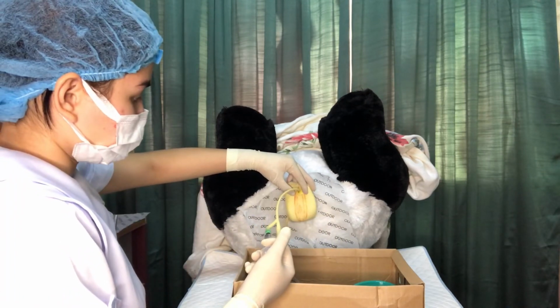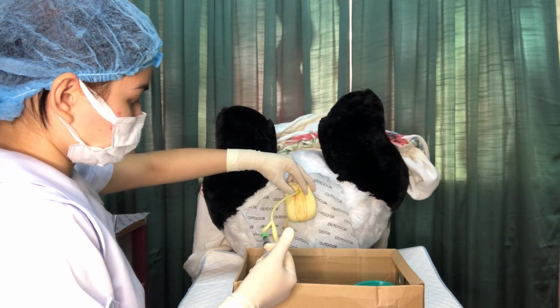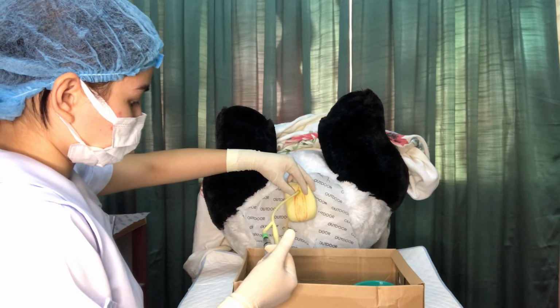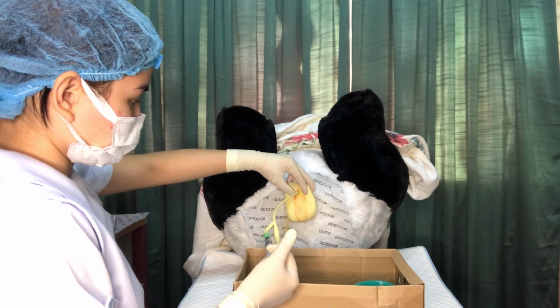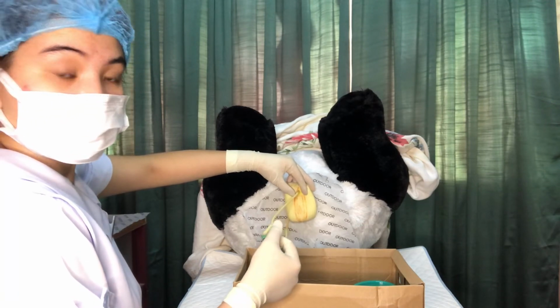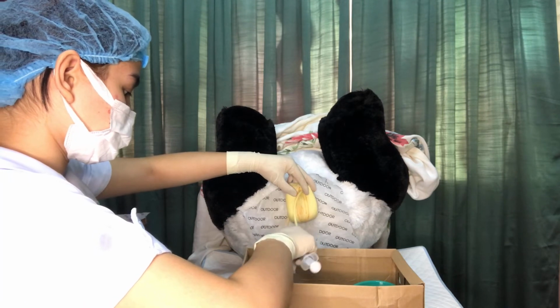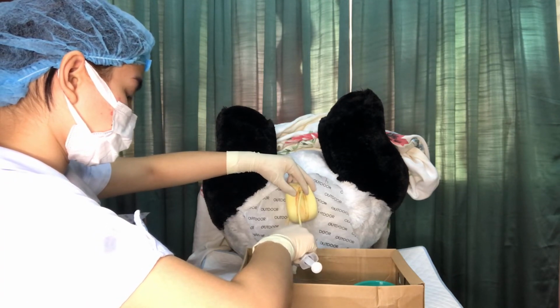So after we've inserted it, we're going to inflate the balloon. So slowly push the syringe and then hold the labia minora. So bear with me again on this one because I'm really having a hard time since the sponge was about to fall off.